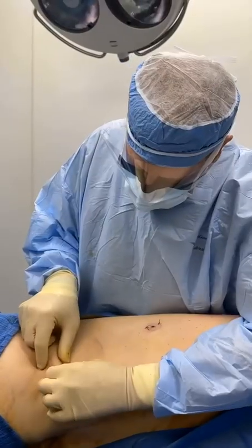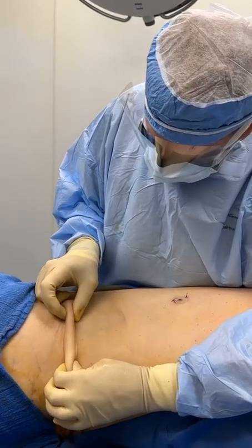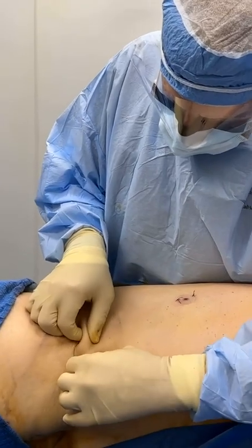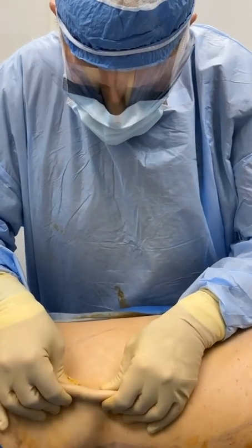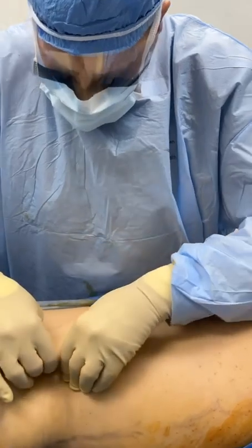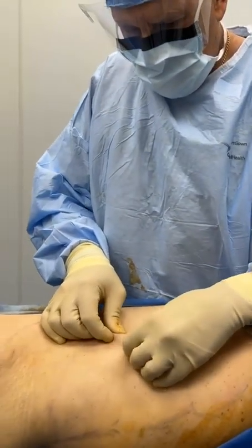Same thing. So we are done with this again. See, this is the pinch test, right? So no excess fat here, no excess fat here, you see? And like that. So you can go this way too. You can see it better this way. See, no excess fat. That's what we do in a nice waist. And it's like that all over.